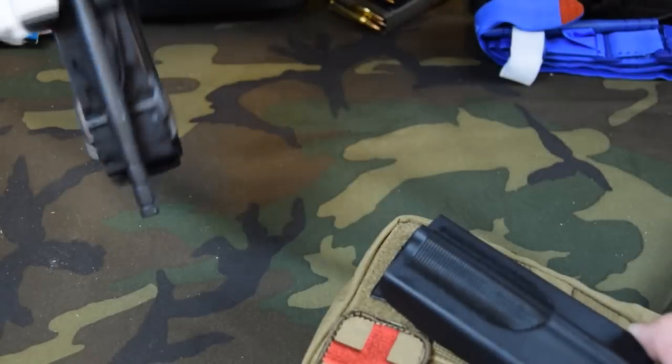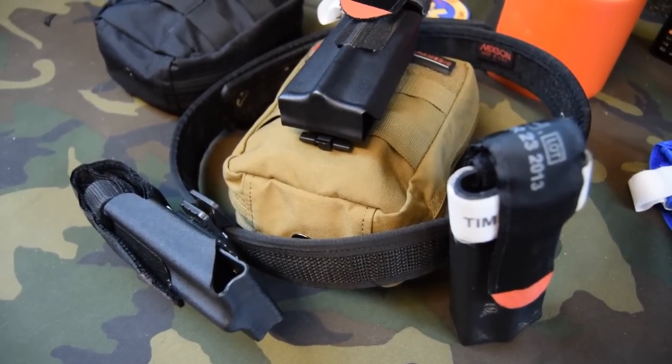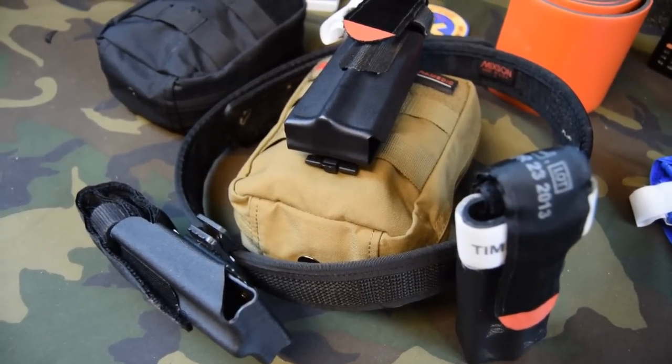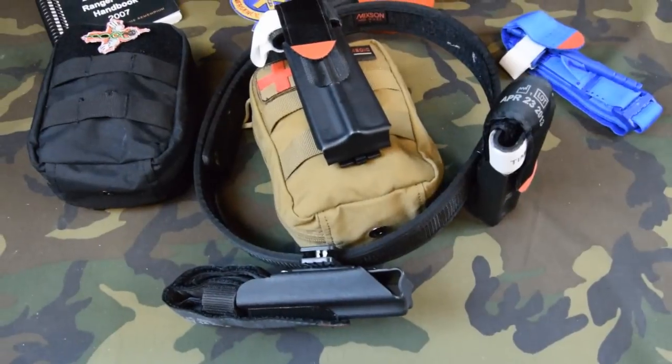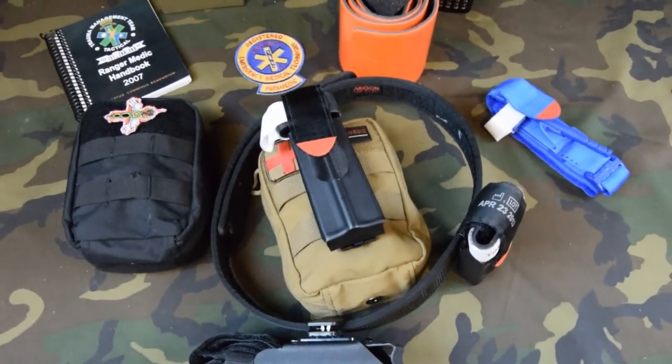So then you pull your tab and the tourniquet comes out. I'll put a link down below so you can click on it to visit my web store where you can see the Skinny Medic CAT tourniquet holsters. You can also see my different IFAKs. Thank you guys for watching. You never know when you'll be the first responder — remember, you need the right gear and the right training.